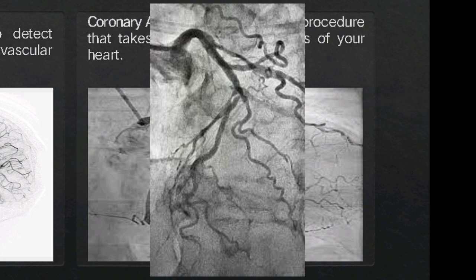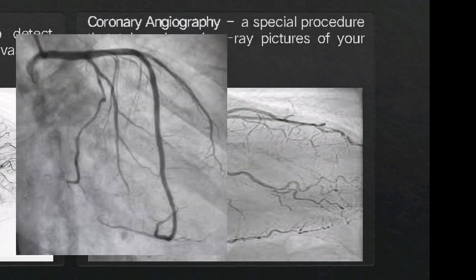If the cardiologist requires a view of the right ventricle of the heart or of the tricuspid or pulmonic valves, the catheter will be inserted through a large vein and guided into the right ventricle. The catheter also serves the purpose of monitoring blood pressures in these different locations inside the heart. The angiogram procedure takes several hours depending on the complexity of the procedure.